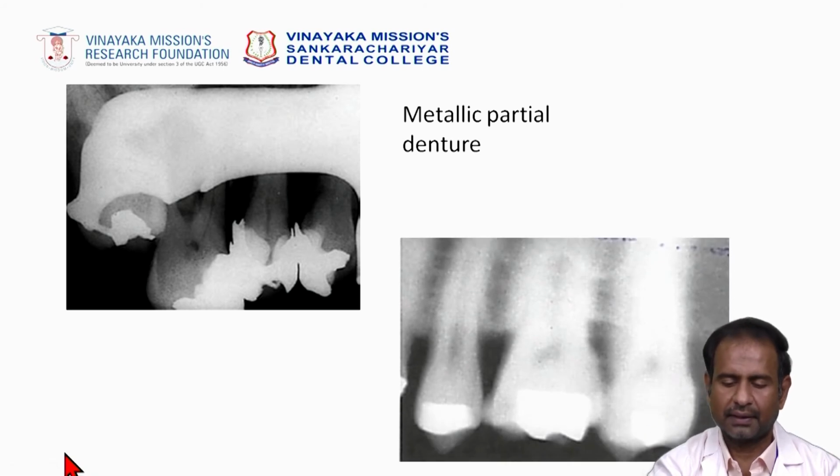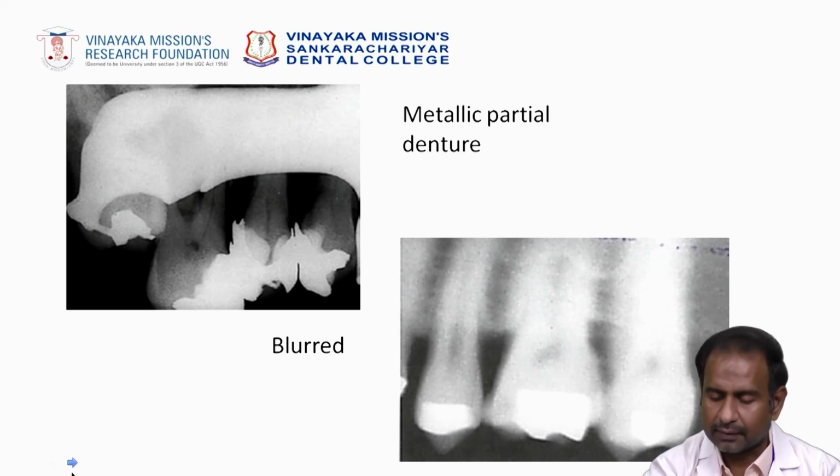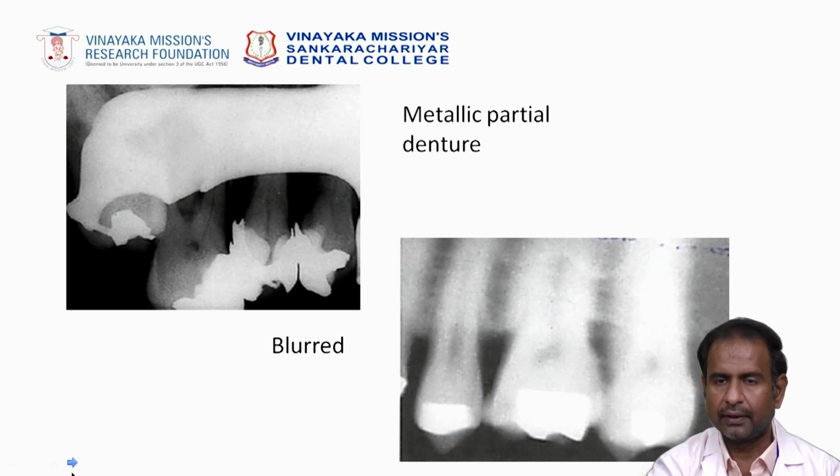Okay, next one. What is this? It's a blurred image. The image is not clear. This is an unclear image due to motion, the patient moving during the exposure time.